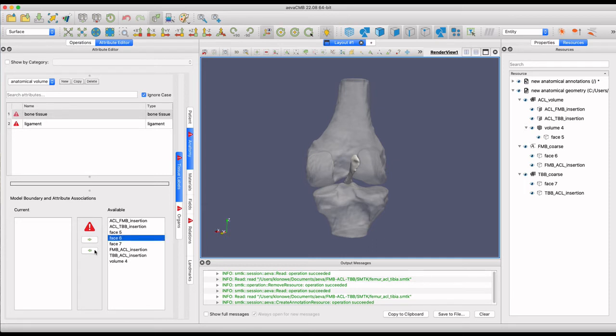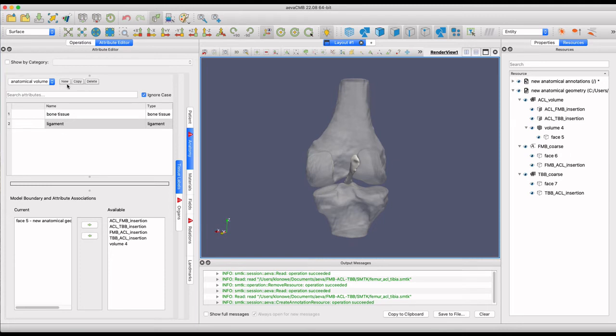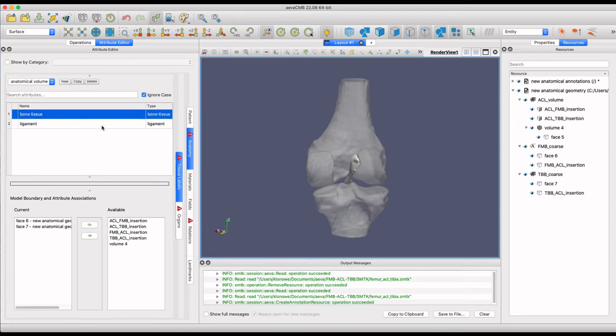Select each geometry to assign to either bone or ligament in this case. The arrow moves them over to the current box to complete the annotation.